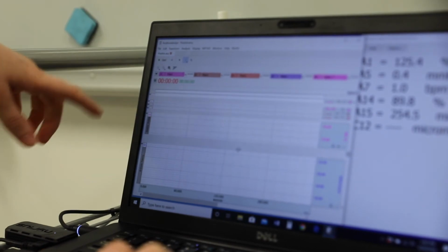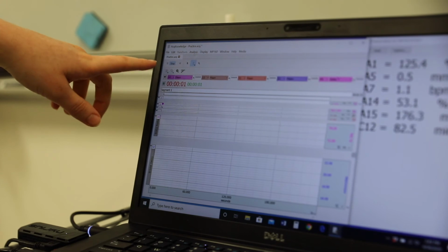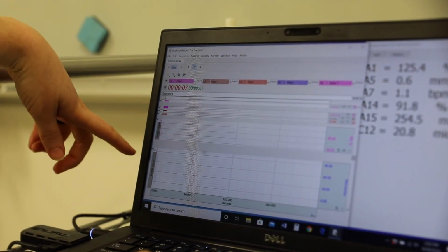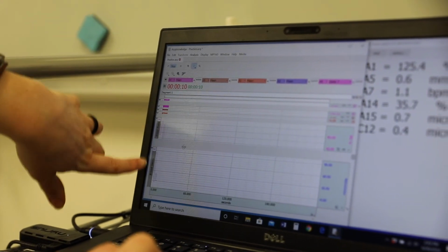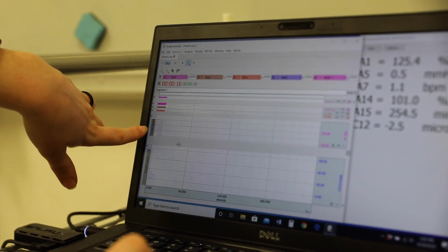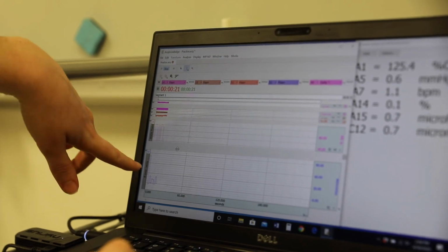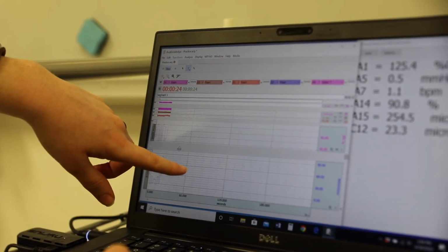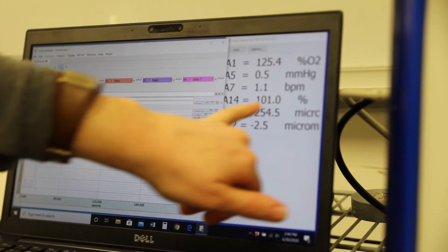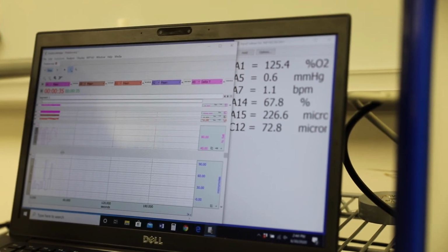You want to come back over here to this computer, and we're going to come up here and click Start. You can also click on Display and Auto Scale Waveforms so that it'll auto scale these two specific measurements that it's taking in from the NIRS probe. This is the saturation of oxygen that it's reading and the total deoxygenated blood. And so as it's reading that, you can tell it's accurate because you come over here to this percentage and it should be somewhere around that 70 to 90 range.